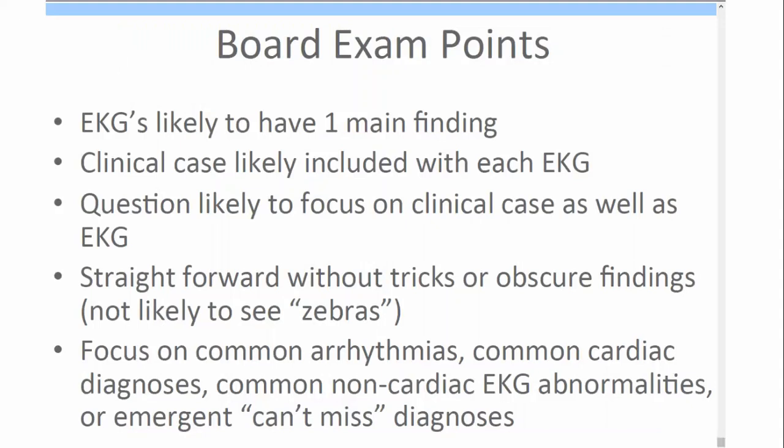I hope this was helpful to you. Again, look for one main finding, clinical cases usually with EKG, and focus on the common things that you would want to see.